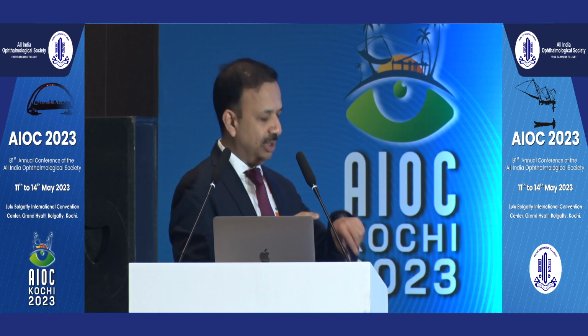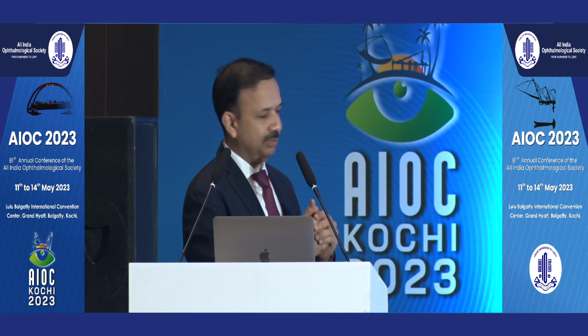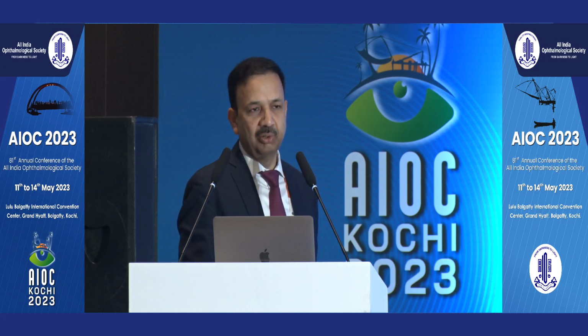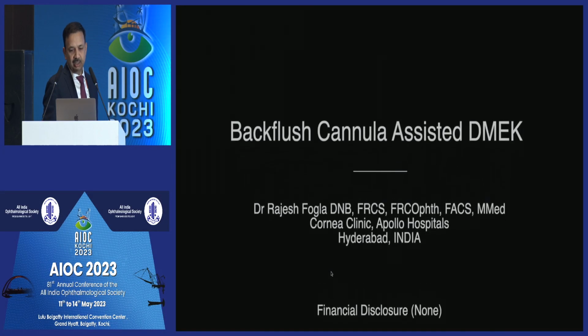If we have, I think we still have time, I can just show a 2-minute video. This is something again related to the DMEK surgery. Can I have my, yeah. So this is, I found a backflush cannula from the retinal surgeons very useful for this.